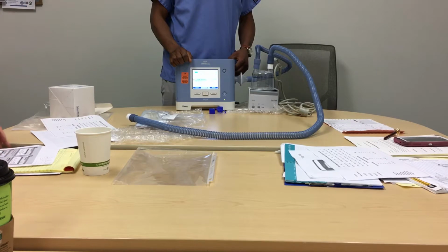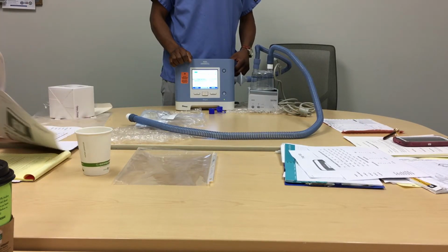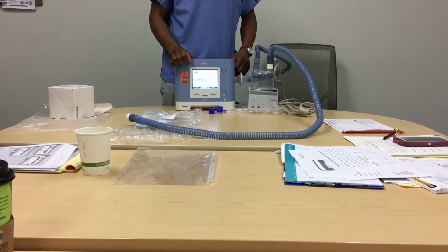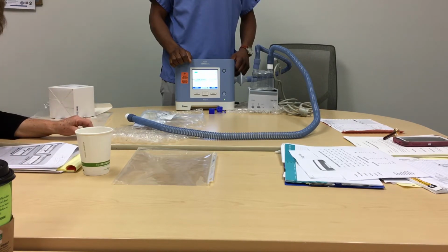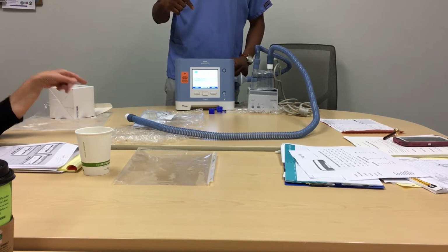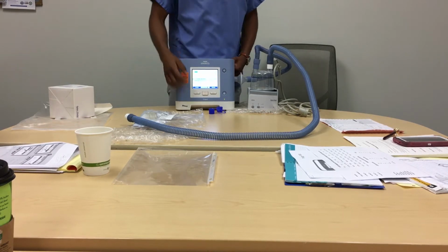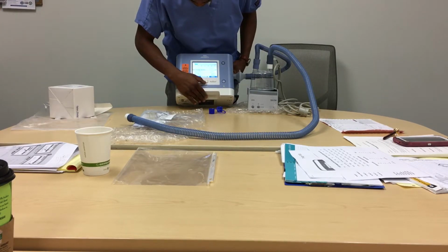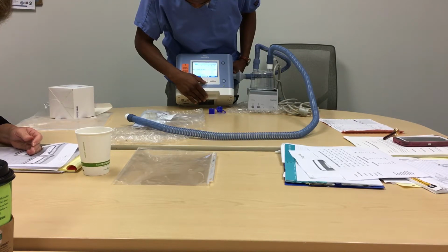Gotcha. We're probably not going to be making changes ever, but we need to understand it when a patient comes to us with problems, or when we have a patient in-house that we're watching for a couple nights before they go. So on this one, it doesn't adjust for the nebulizer treatments? Once you have it on, yes, it will. In other words, if the patient's on nebs, we just turn it on and leave it on. The trigger. Yeah. So we need to put that in the prescription comment: patient neb treatments Q4, so that they're not adjusting it each time. That was my question.